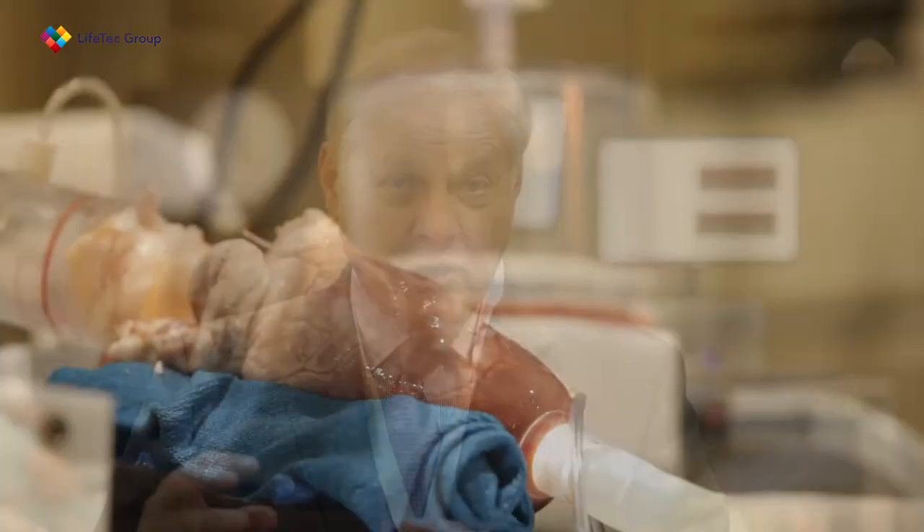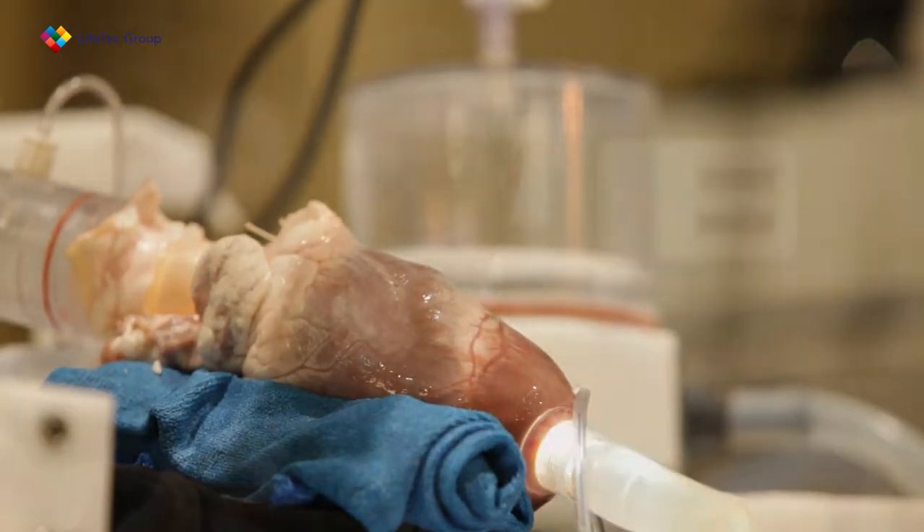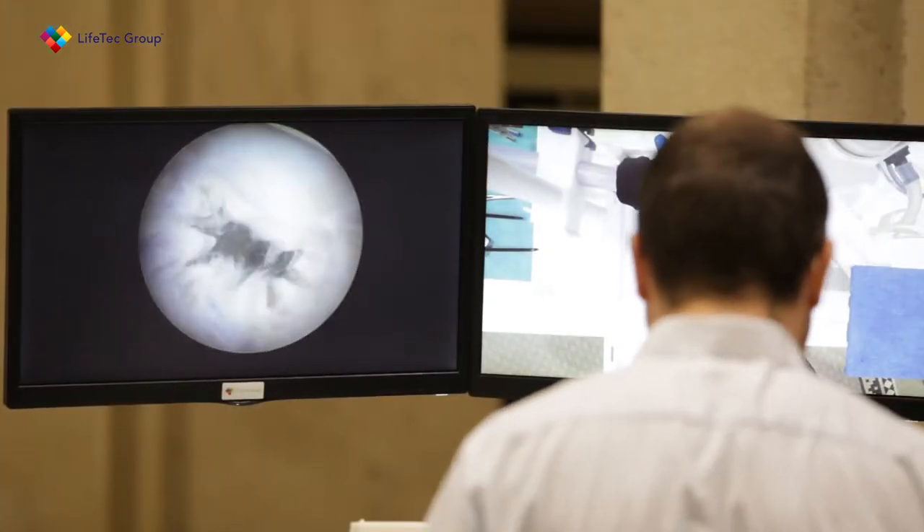This device emulates directly the human heart. You can use it for looking at the aortic valve, for different transfemoral techniques, whether it's TAVI or a mitral clip. It most closely simulates the human heart of any simulator that I've ever seen.